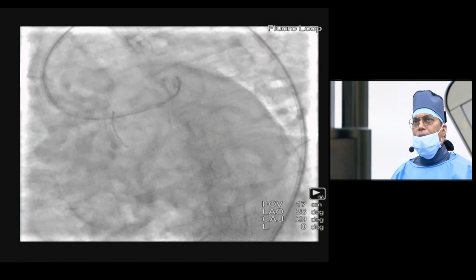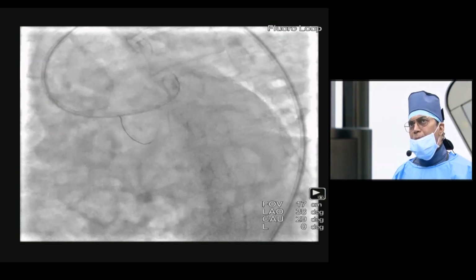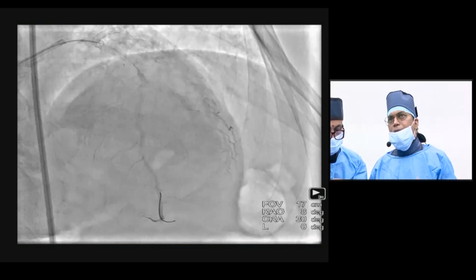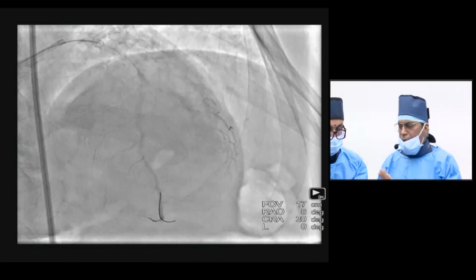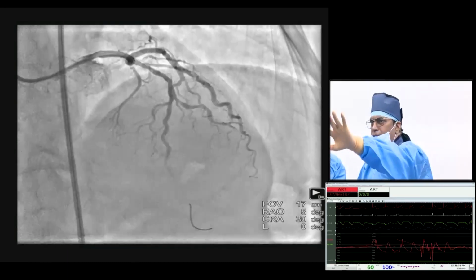Now here go with 120,000. Definitely, because the area is bigger, the burr movement will maintain 1 mm, so that you can get a bigger area of ablation. Orbital atherectomy, then we'll proceed. Otherwise we can go down until that area, and then we'll go to 80,000 because the distal vessel is small. Now you can see the ST elevation also on ECG.